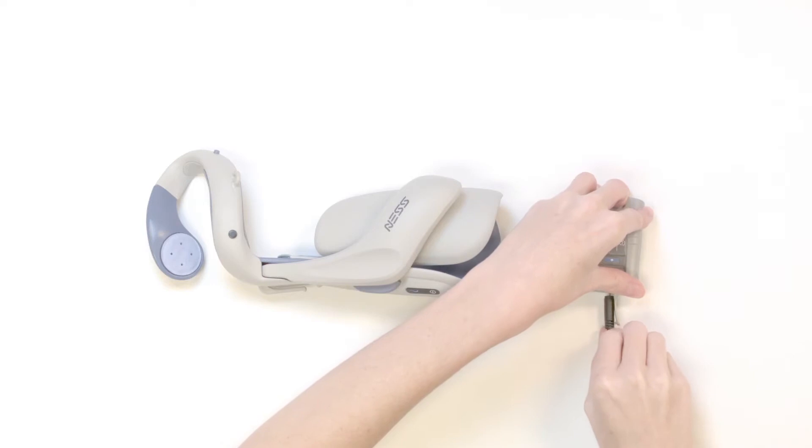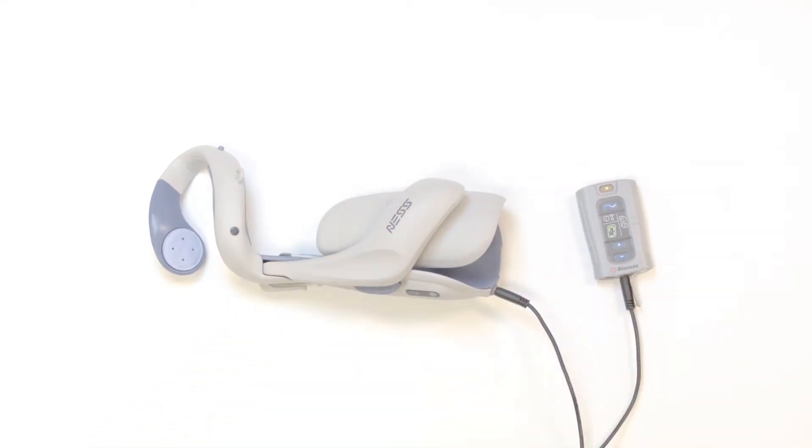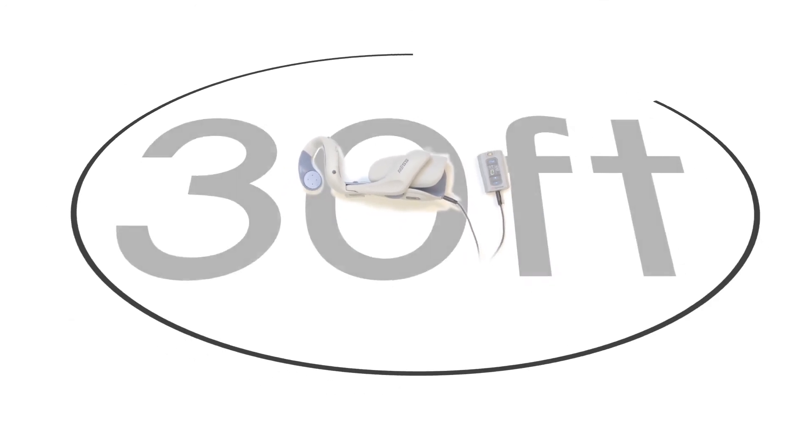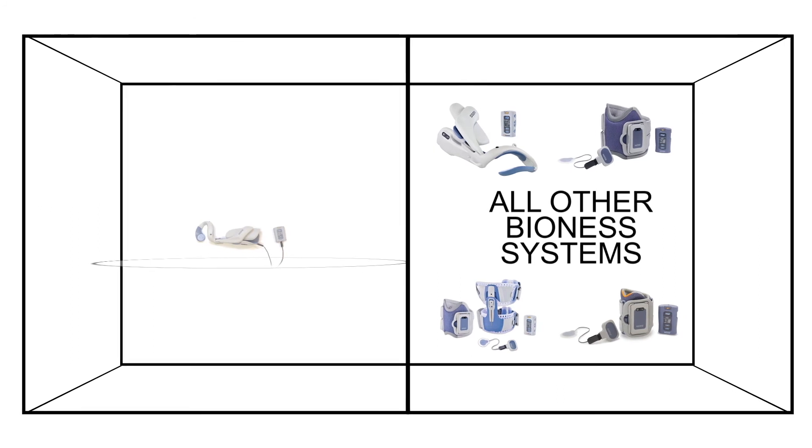First, confirm you have the correct H200 wireless components and plug them in so that they are charging. Next, make sure your H200 system is 30 feet away from any other Bioness systems. Put them in another room. It's important not to link your components to another system.